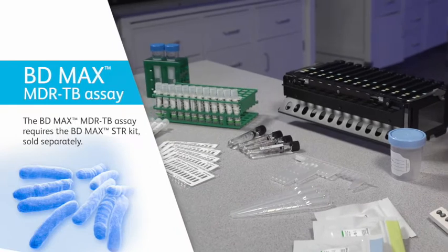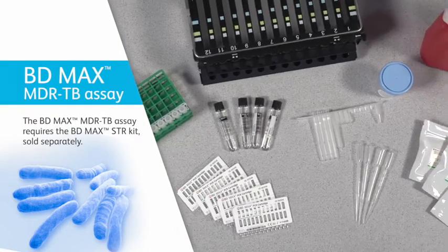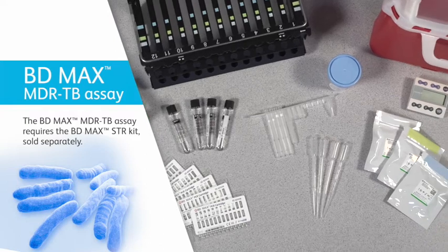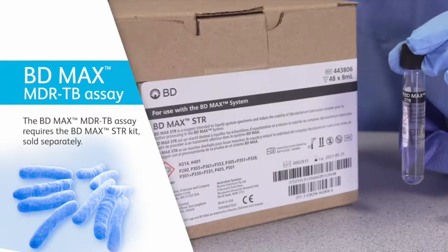The BD-MAX MDR-TB assay is for testing raw sputum or concentrated sputum sediments prepared from induced or expectorated sputa and can only be used with the BD-MAX STR kit.